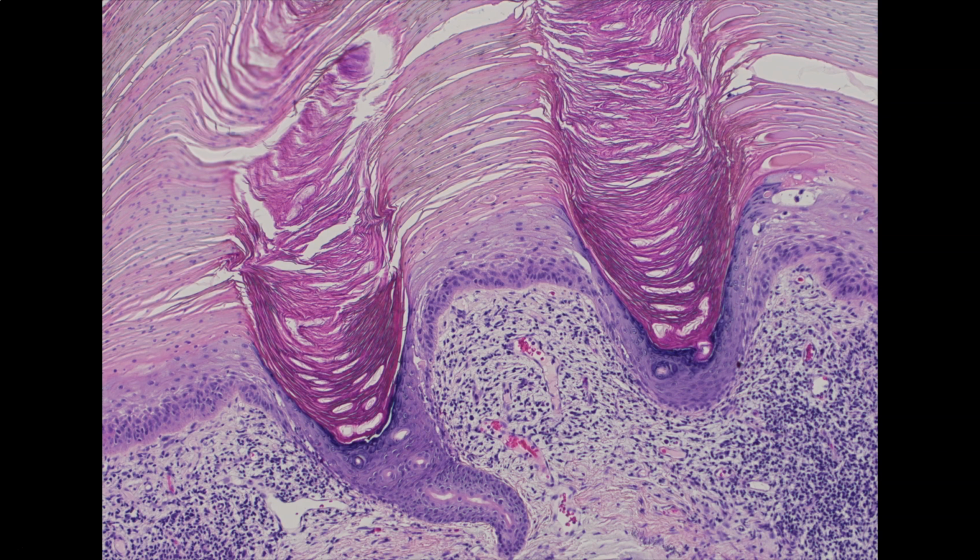I have a whole video about actinic keratosis and squamous cell carcinoma that you can check out. But what's interesting is that in actinic keratoses, you get the atypical cells here in the epidermis, and then here and here they're down the basal aspect. The lower aspect of the epidermis is atypical, and then they mature to the top and make a big, thick layer of parakeratosis up there. That's beyond the scope of this video, but look at how they spare the acrosyringium.